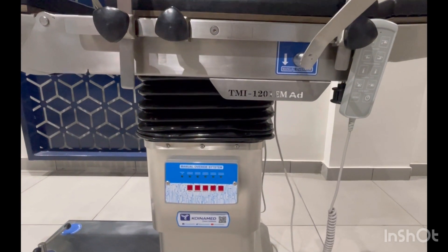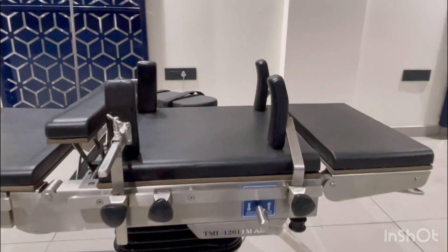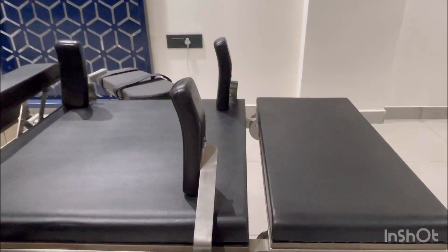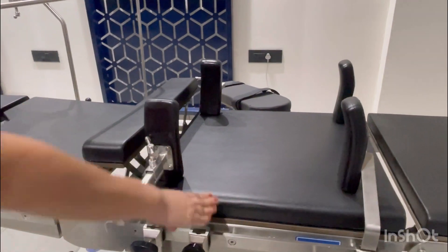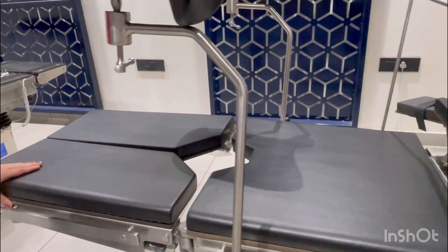The table operates electrically as well as manually. It has five sections: head, backrest, kidney bridge, pelvic section, and the leg section.